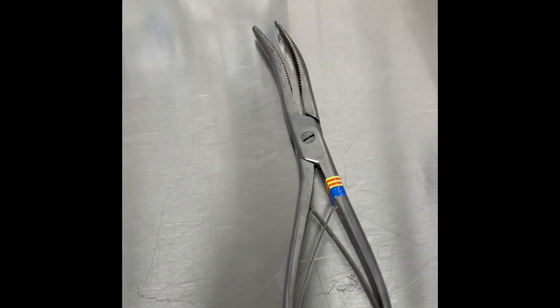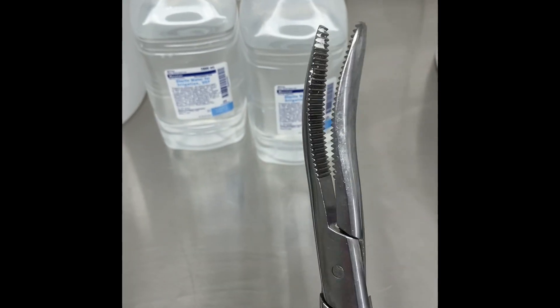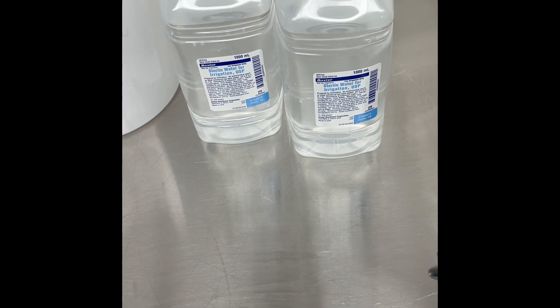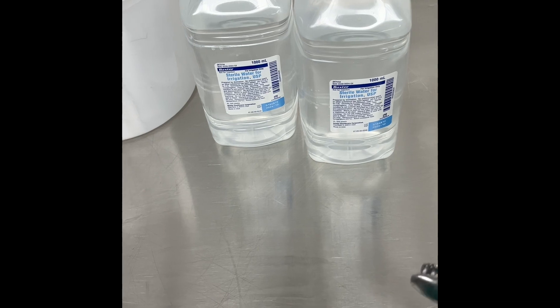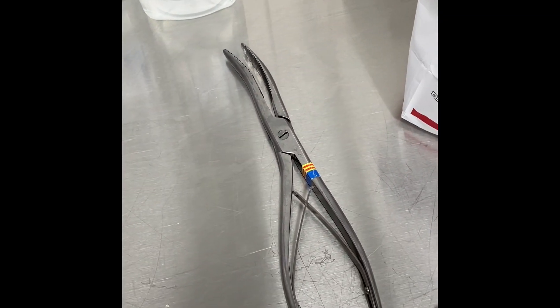We also have this instrument — we call it the 'ex-mother-in-law.' I don't know the actual name of it, but it's used at the end to try to make the toe box a little bit more oval so that the pinky toe isn't being smooshed in the cast itself.